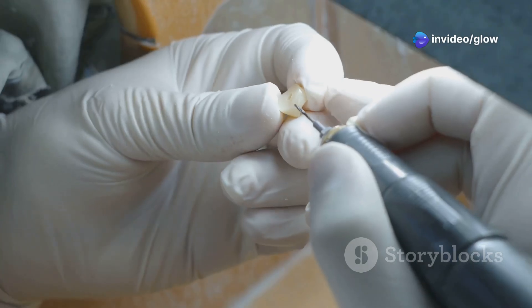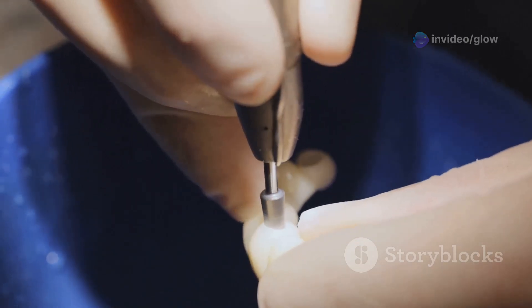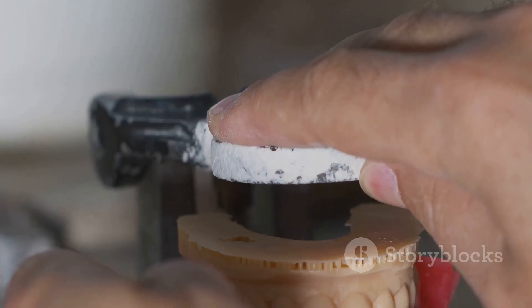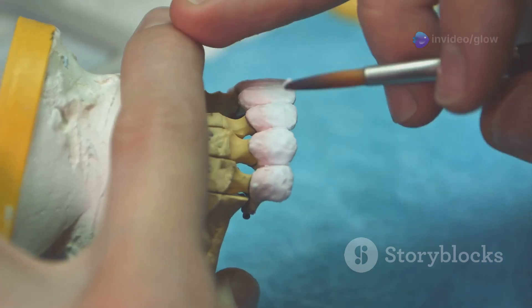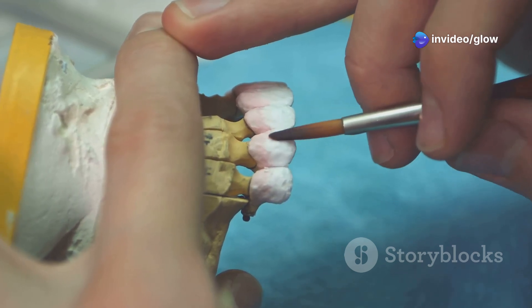Then comes pulp protection — be extra gentle here, especially if you're near the pulp. The goal is to avoid exposure unless absolutely necessary. If you're close to the pulp, you can use a liner like calcium hydroxide or a base such as glass ionomer to insulate and support the restoration. Safety first, always.